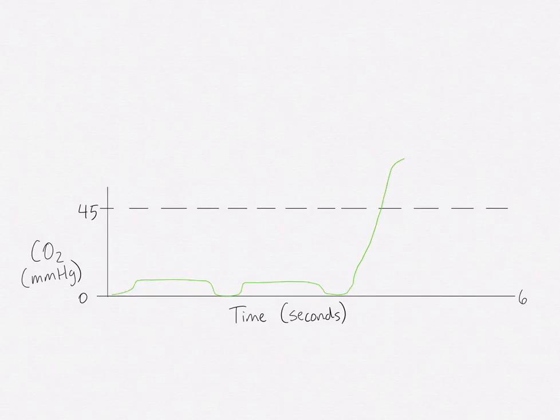If during the code, the end tidal reading rapidly increases to over 45 mmHg, return of spontaneous circulation has been achieved. This spike in end tidal occurs because the body has been accumulating CO2 due to reduced perfusion from only compressions. Suddenly, the heart kicks in and begins perfusing blood at a greater rate, releasing the built-up CO2.